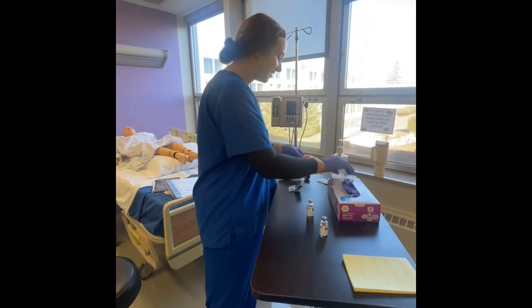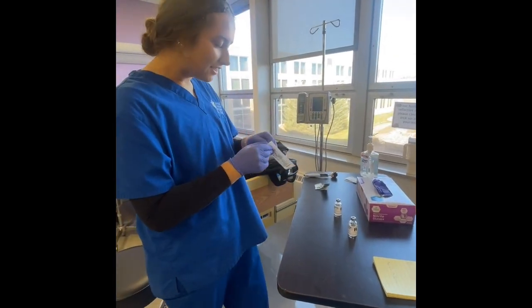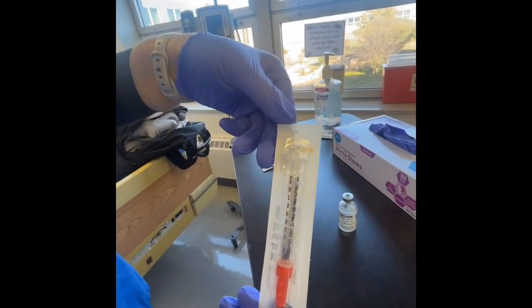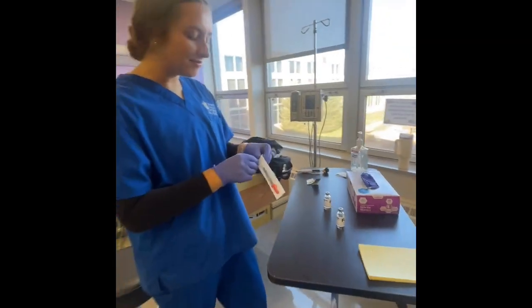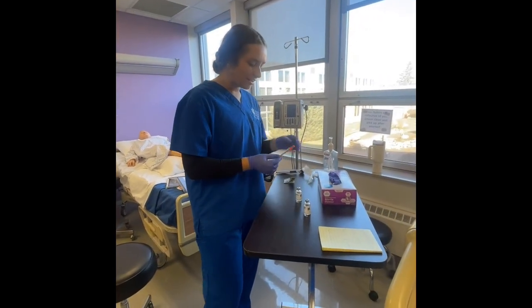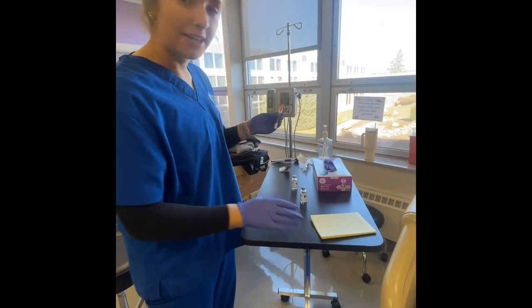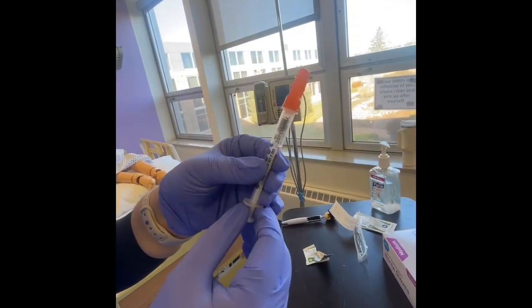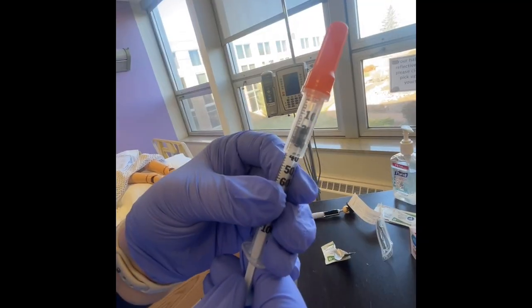Now I'm going to grab my needle, and as you can see, this is the correct insulin needle. We're going to inject air into NPH first, so I'm going to draw up 20 units.